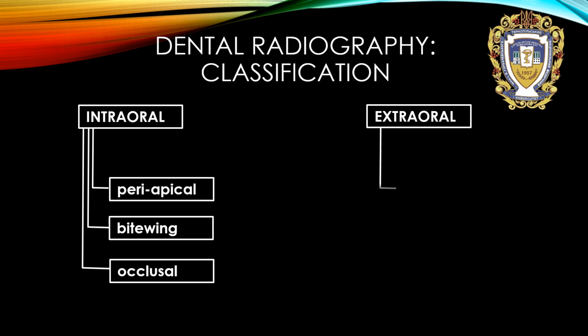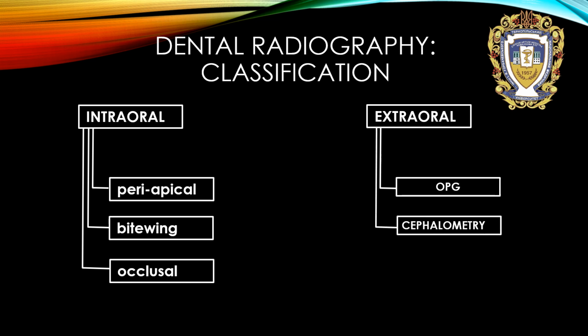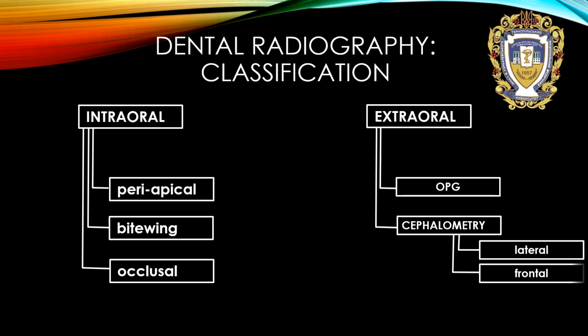Extraoral X-rays are divided into panoramic X-ray or orthopantomography, cephalometry, where cephalometric X-rays are divided into lateral and frontal, and sialography.